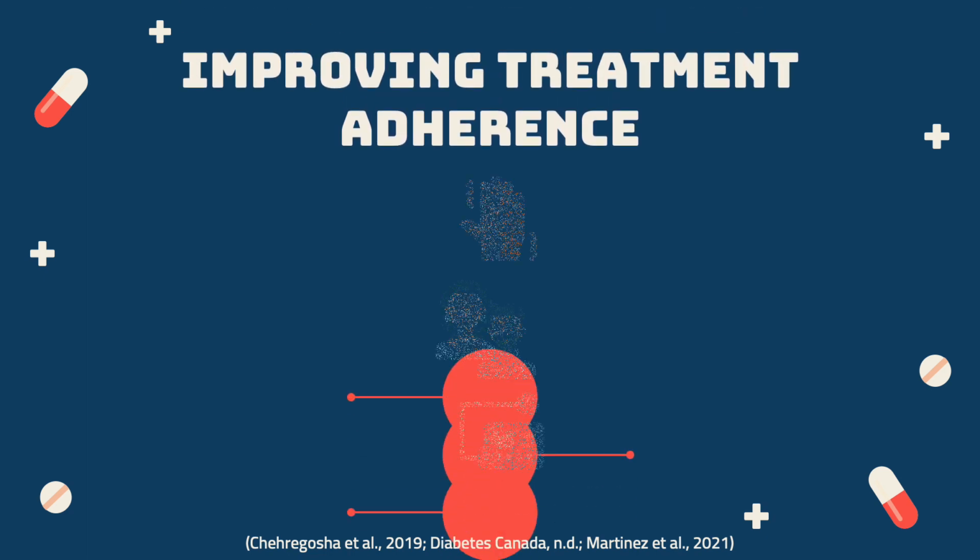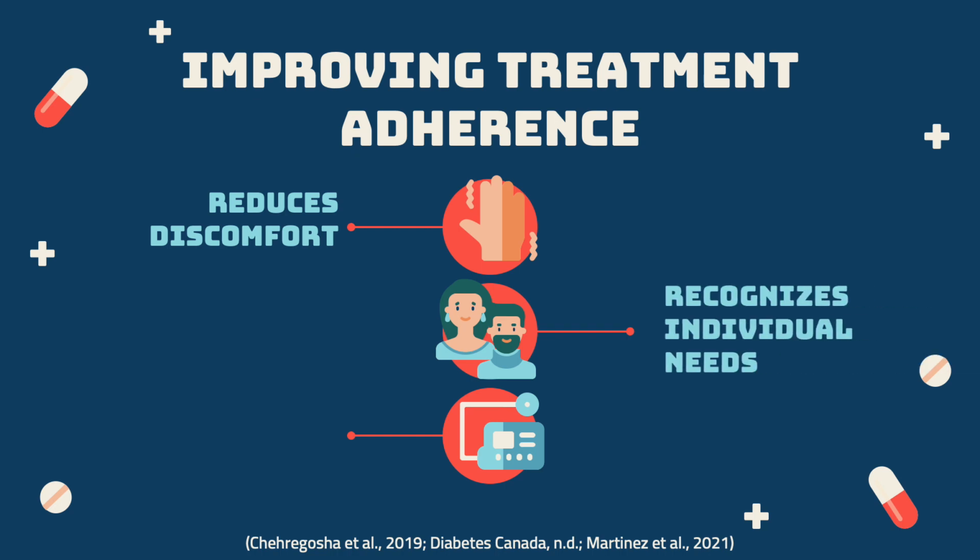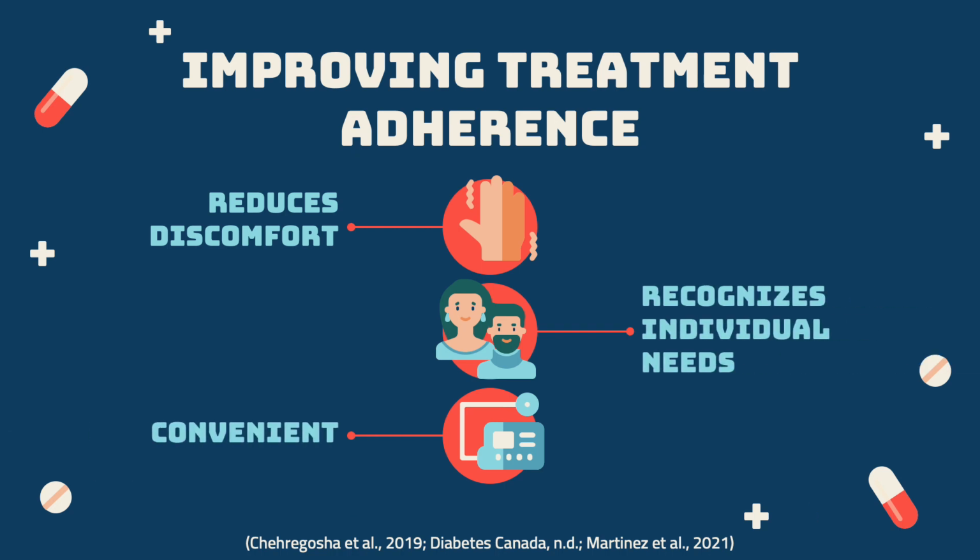Continuous glucose monitoring is a relatively non-invasive way for diabetic patients to stay informed about their glycemic values while minimizing the frequency of uncomfortable finger stick testing. Their sensors are replaced every 7 to 14 days and can be worn during bathing and activity. Calibrations of the device require finger stick testing and will vary in frequency based on the model, but overall, patients experience fewer needle sticks with continuous glucose monitoring.